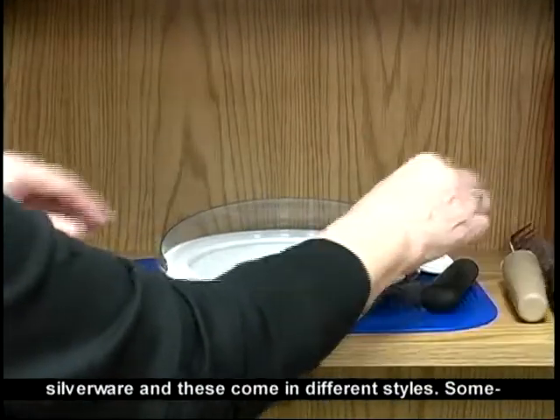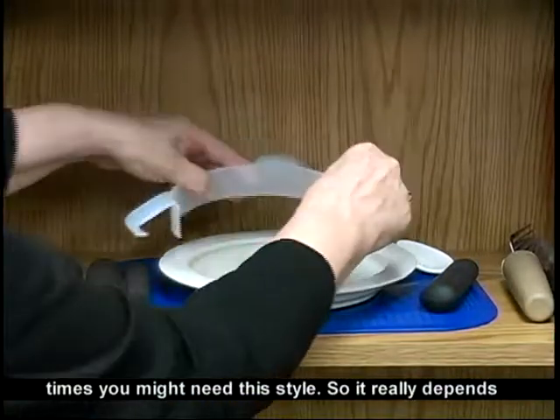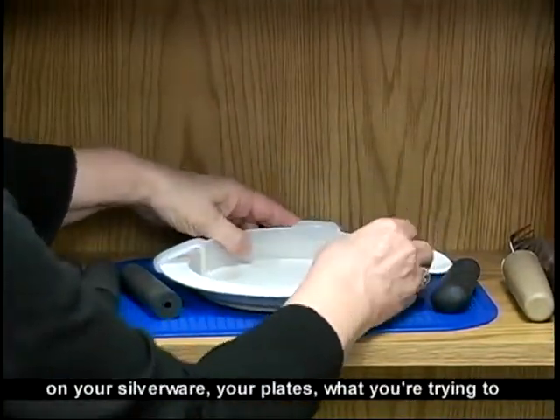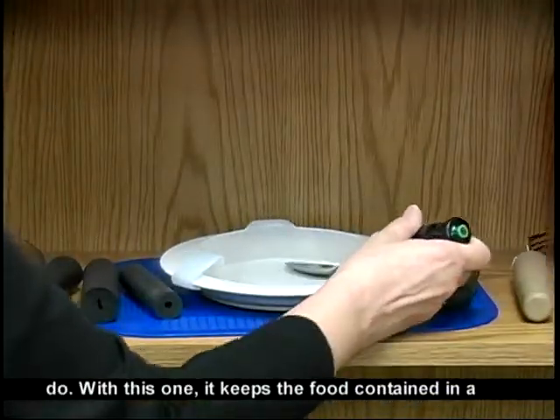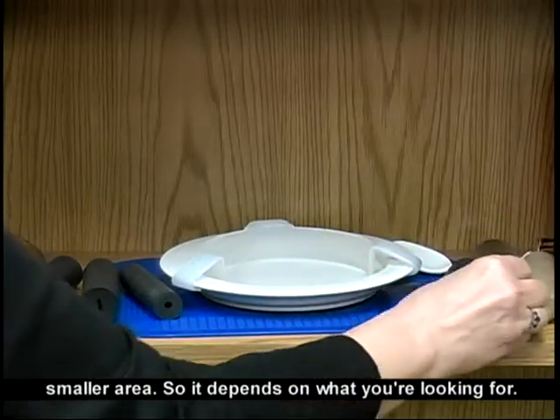And these come in different styles. Sometimes you might need this style. So it really depends on your silverware, your plates, what you're trying to do. With this one, it keeps the food contained in a smaller area. So it depends on what you're looking for.